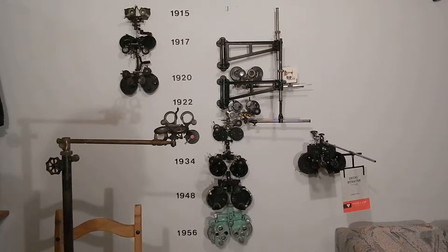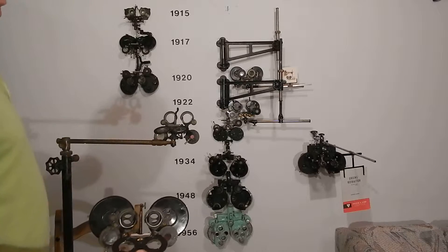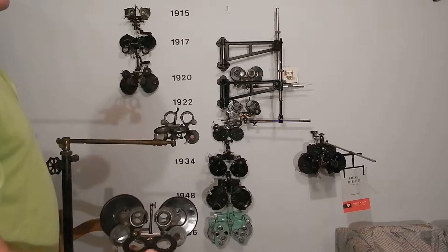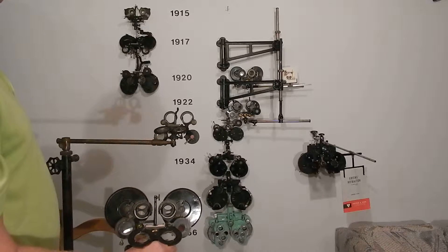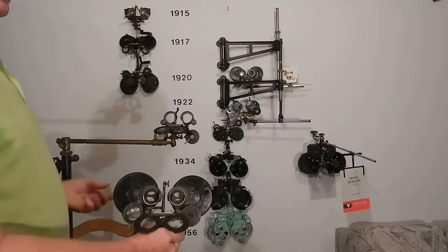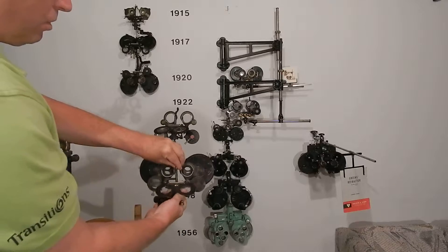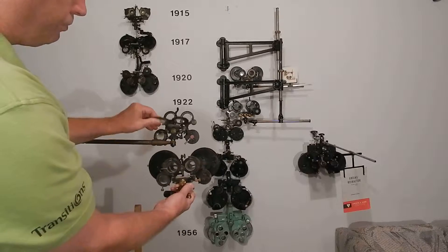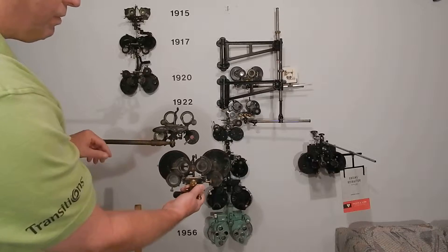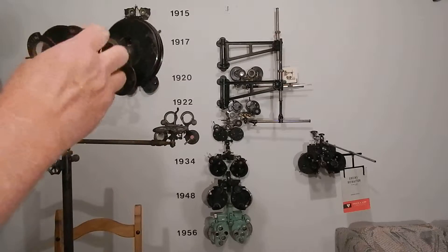The big thing in the late 1800s was trial frames and trial lenses. Bausch & Lomb came out with their first trial lens set in 1903, and American Optical had one in the late 1880s — they were the first ones measured in diopters. Before that they were measuring in inches. You can see these are the same, but what makes them different is the disc system.